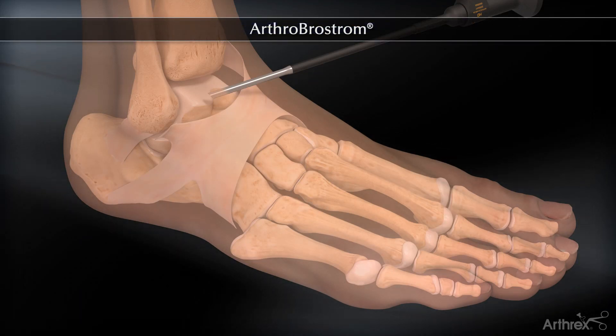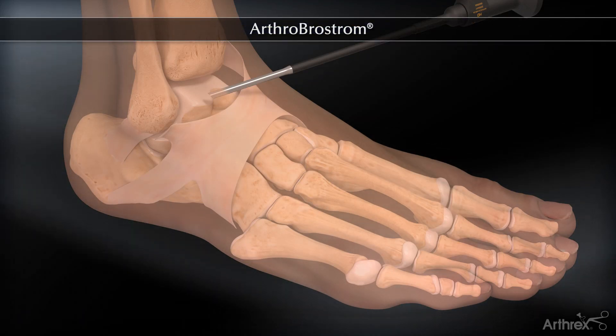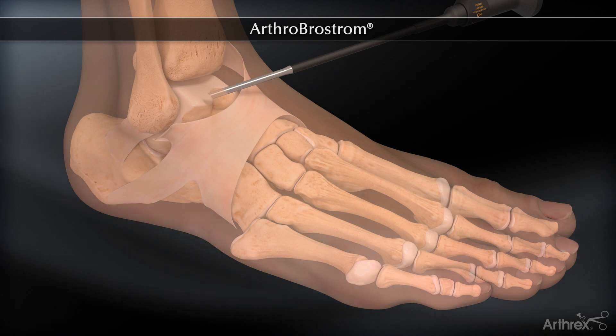Arthrex presents the ArthroBrostrom Technique and Implant System, developed by Dr. Jorge Acevedo and Dr. Peter Mangon.